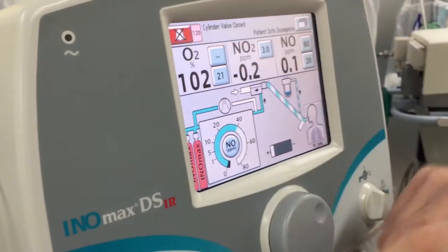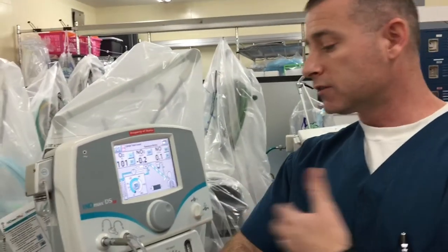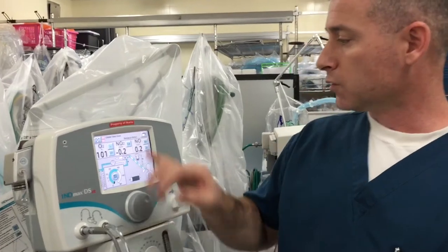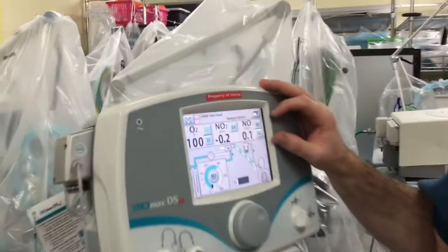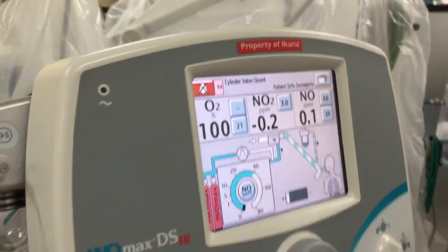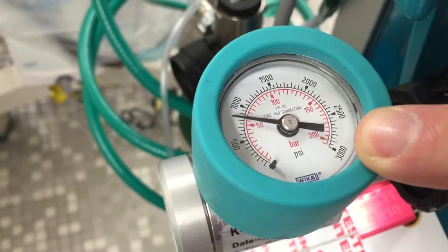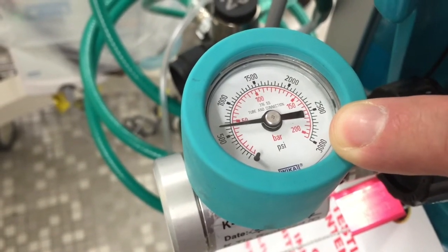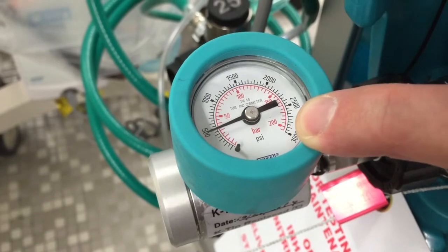You can close that — the alarm is just telling you that your tank is closed, which is helpful if you're actually dosing a patient, but in this situation we're just checking the alarms and purging the system of gas. Hit silent on that. Your nitric oxide will go up and then come down, and if you look at your pressure gauge you'll see the pressure is actually dropping. If the pressure doesn't drop, that means your tank is still on and you'll have a continuous flow of nitric oxide, which means we won't get our alarms to sound.